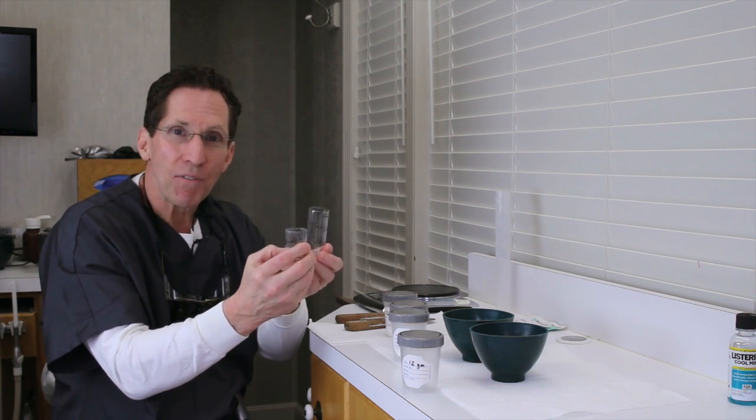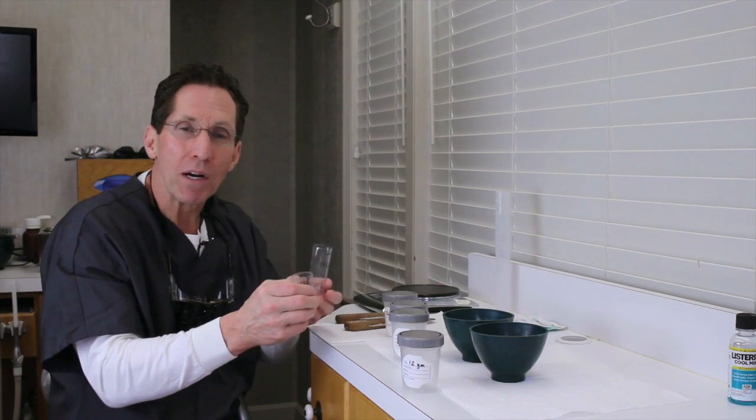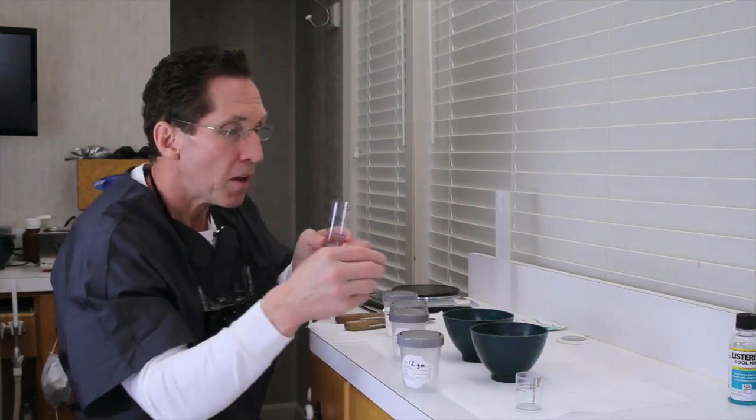So the assistant doesn't have to do any measuring. All she has to do is literally scoop out the water, pour it in, and we're going to have a very, very consistent mixture. Now, the next thing that's important, again, from the standpoint of our consistency, is our setting time. And again, the setting time we're going to control by the water temperature.